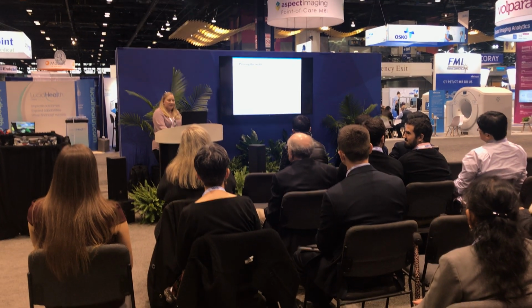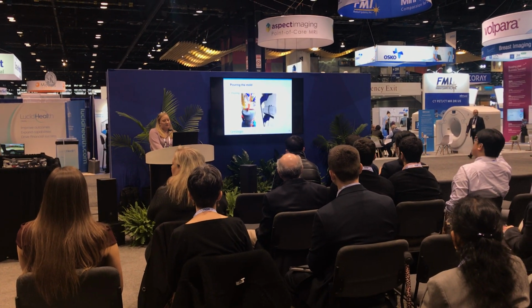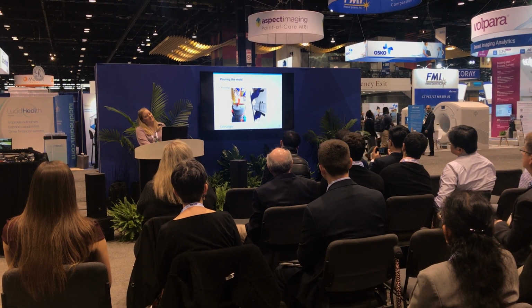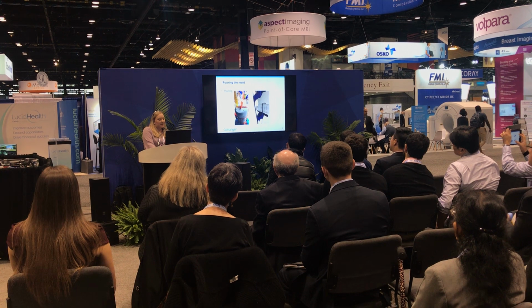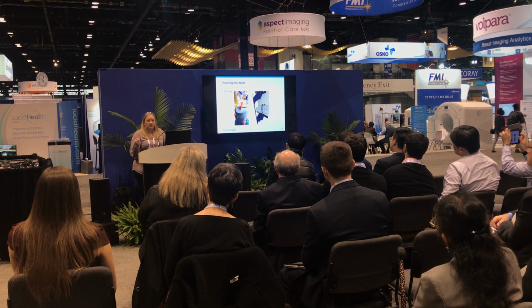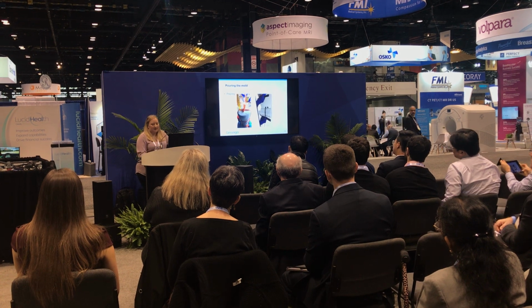After you degas your silicone, you're ready to pour. And like I said, I don't know why that's sideways, but I'm in a medical background and I just really like syringes. You have a lot more control, and it just seems to not introduce any more error into things.